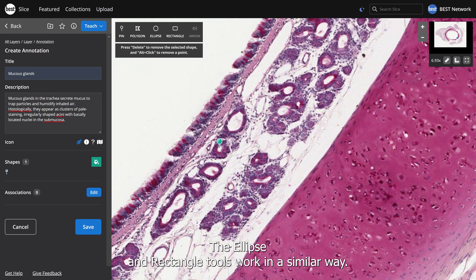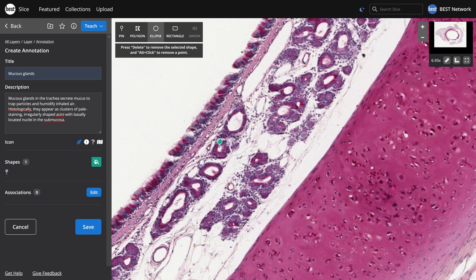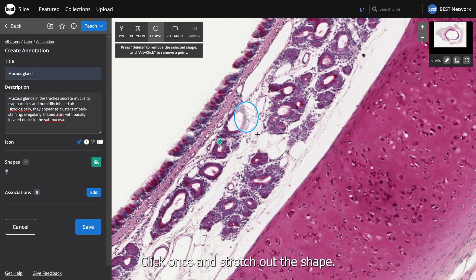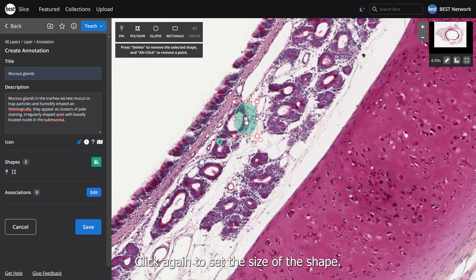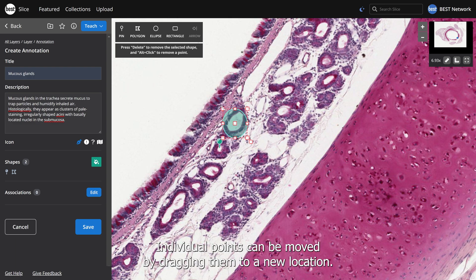The ellipse and rectangle tools work in a similar way. Make your selection and the cursor will change to crosshairs. Click once and stretch out the shape, then click again to set the size. Edit the shape by clicking it and dragging the corners or edges.